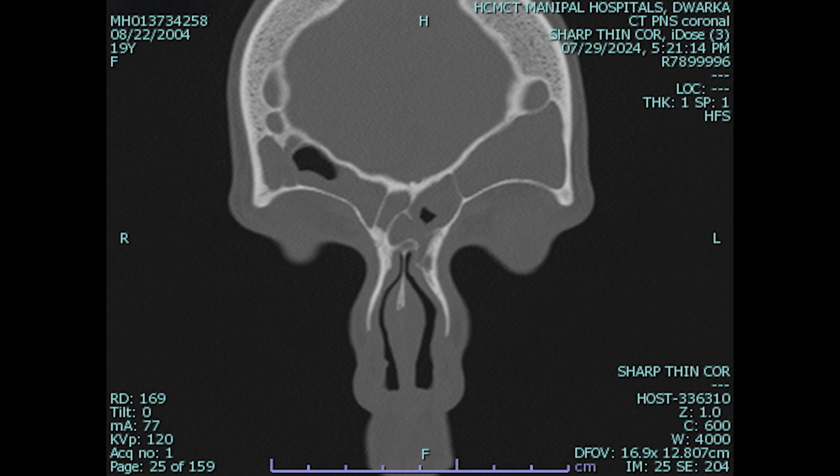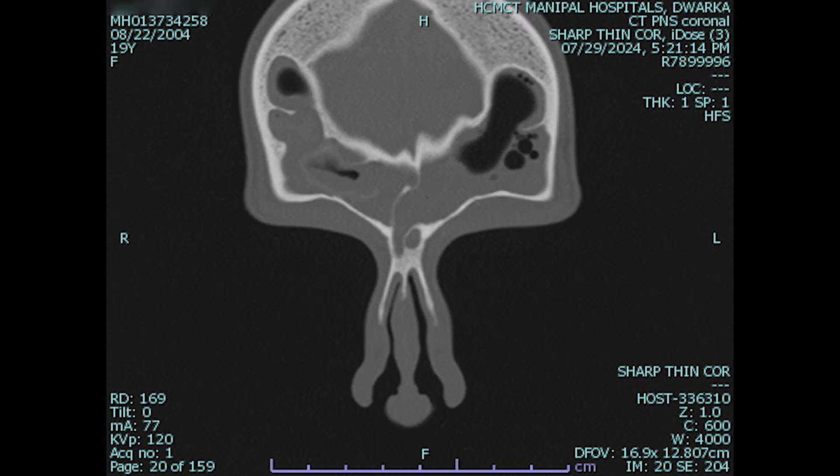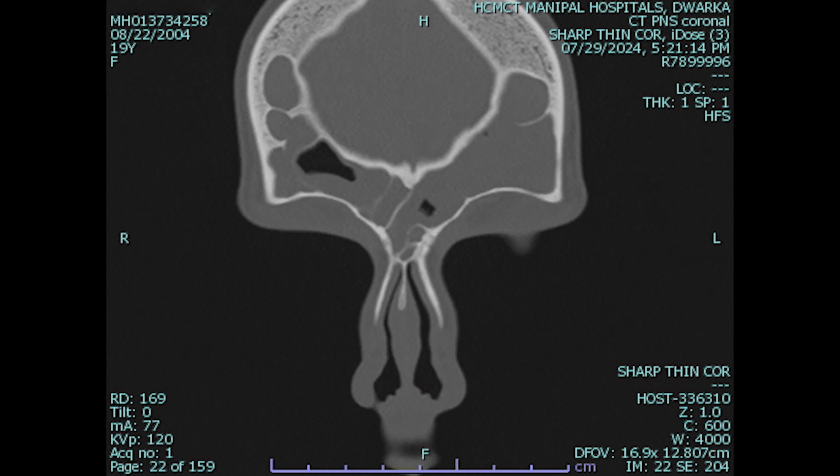On these frontal section cuts, the frontal sinuses are very well pneumatized. There is a cell that pneumatizes inside the right frontal sinus along with the suprabullar cell, making the anatomy of the frontal sinus and recess slightly complicated because of the presence of these two cells. The shadow of the frontal buller cell is very well visible here.